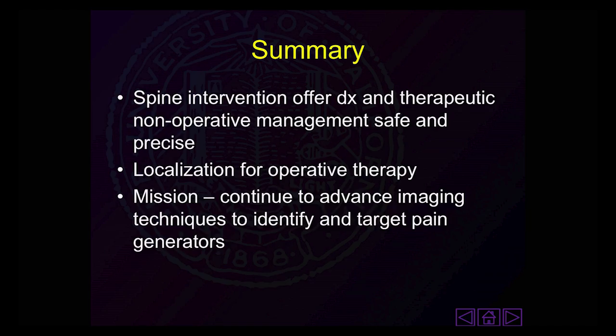And so, just in summary, to end, I hope these examples have shown how spine intervention can be both diagnostic and therapeutic, and how with advanced imaging that allows for precise placement of the needles and the injection, this can be a safe way to manage non-operatively those patients who are not surgical candidates. For those who are, it allows us to localize for the surgeon where the pain generators are. And our mission is to continue to advance our imaging sequences and modalities so that we can more specifically find our pain generators and allow you to have lives that are more comfortable.